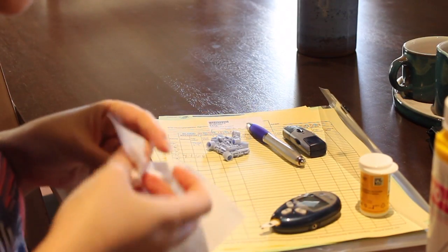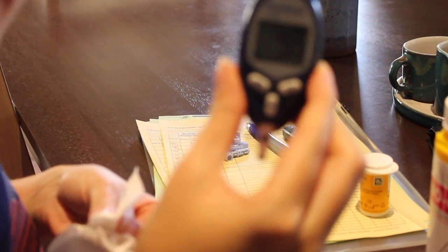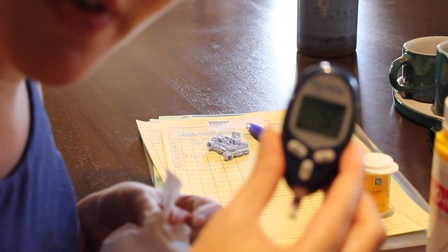Okay, I am going to cover this up. So, see how snappy that was? That's a 5.5. That's in millimoles. Where you live, you might have a different measurement system where it's more around 100.